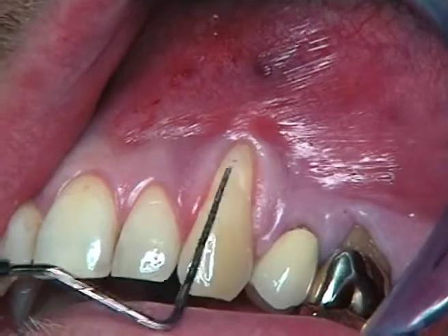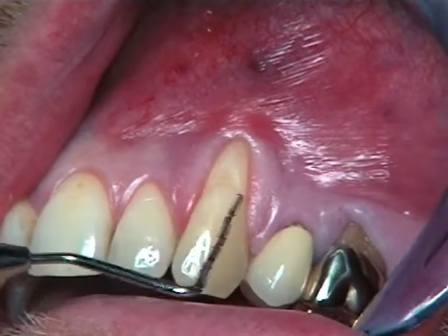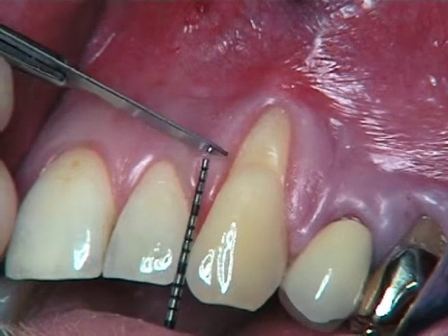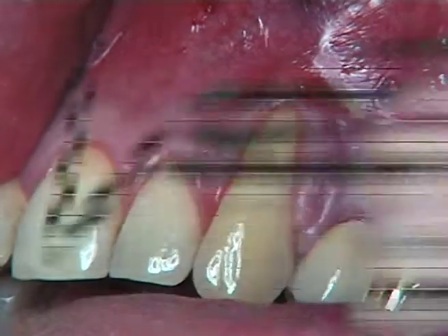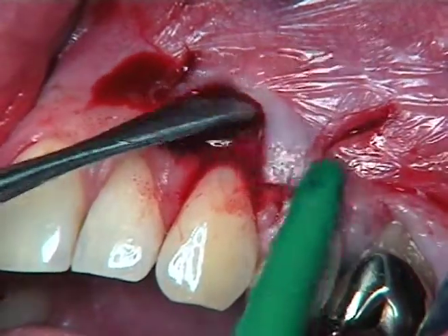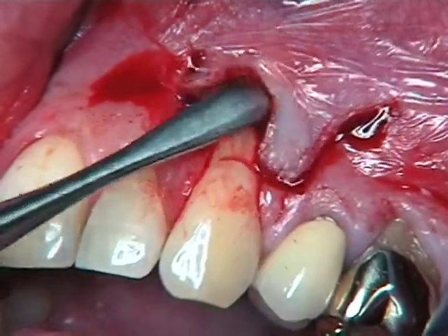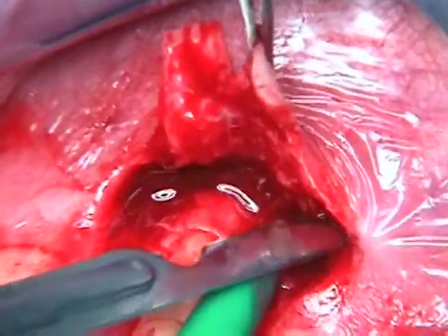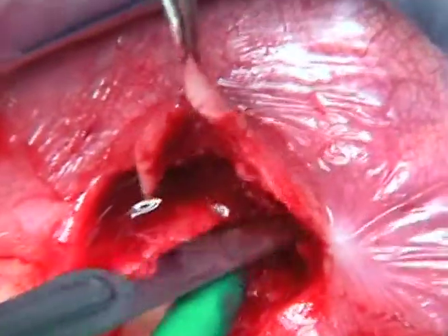Here you can see the recession type defect, and here you will have the first horizontal incision — the small one — in order to reach the bone crest of this tooth with a full thickness flap.